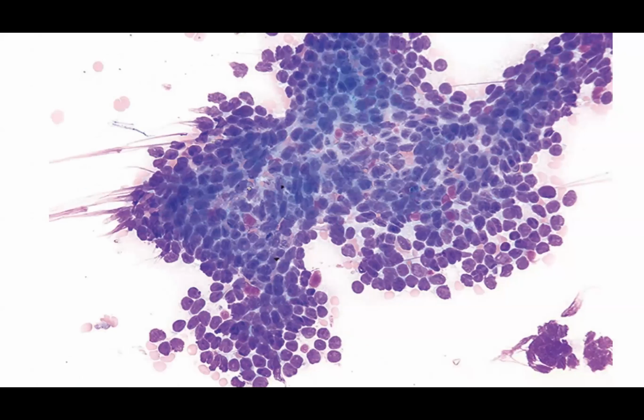Here is another example of a basal cell adenoma. Here the basement membrane-like material is quite small and scant, and you can see that, but it would be difficult to differentiate this from a solid variant of an adenoid cystic carcinoma, hence why a broad category of the cellular basaloid neoplasm is preferred to prevent that pitfall.